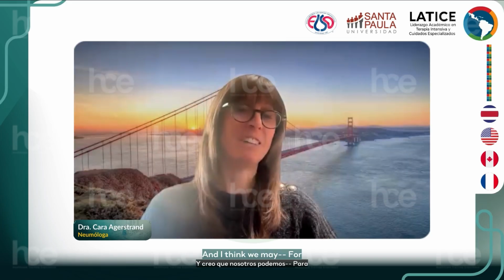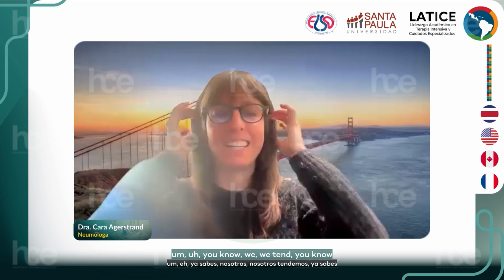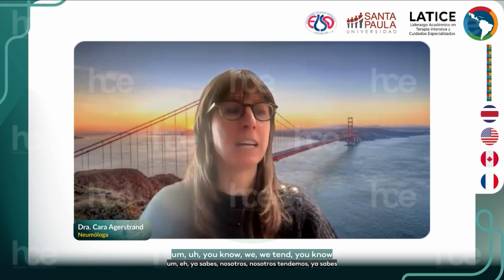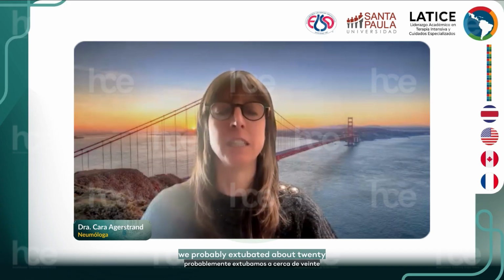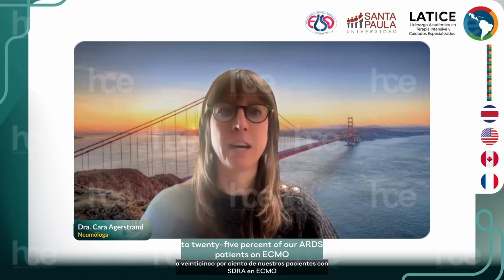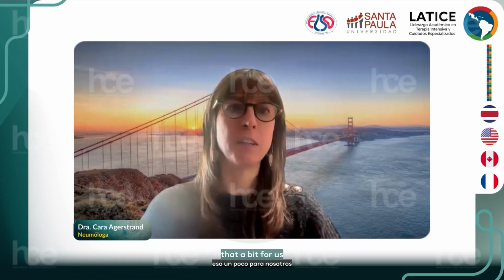And I guess for the extubation question, at least in the pre-COVID era, we probably extubated about 20 to 25% of our ARDS patients on ECMO. I think COVID sort of changed that a bit for us.